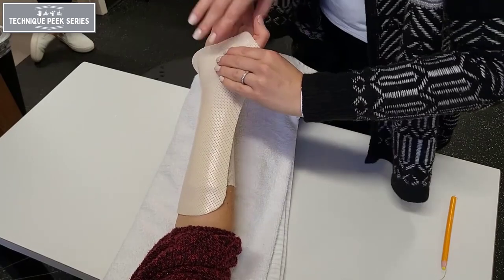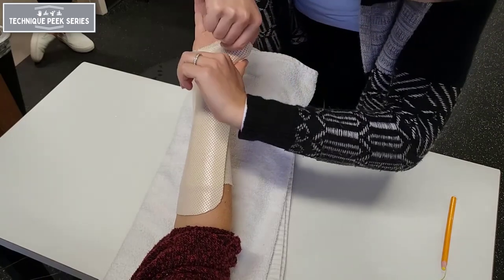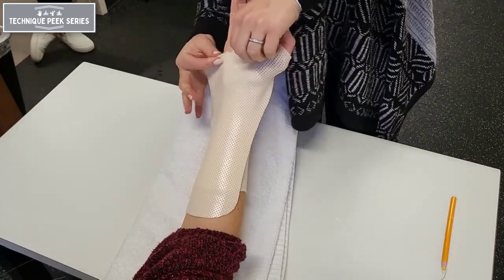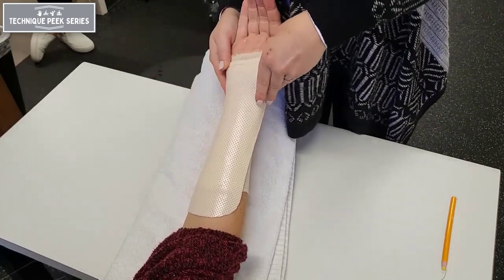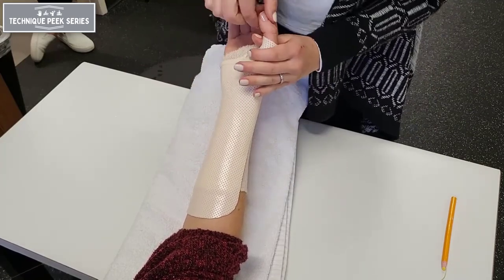First, mold the part around the thumb, closing the crease and pressing securely. Then roll down the edge of the material to clear the distal palmar crease. Use this time to smooth the material along the length of the forearm.